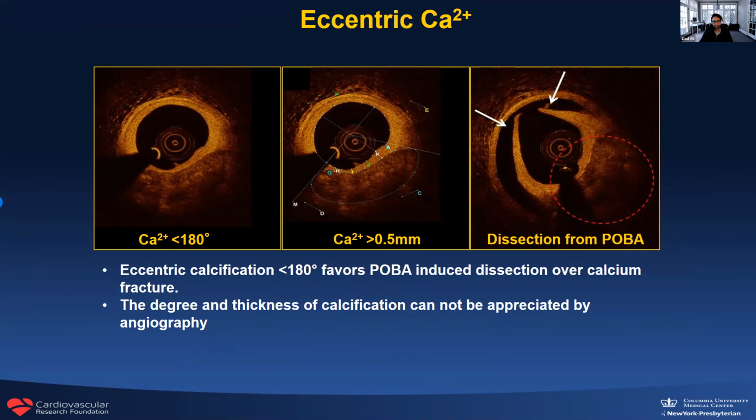fracture in this segment because the bias will always push the calcium away and take the path of least resistance, tearing the intima. If you look at the atherectomy mechanism of action, it is a favorable wire-biased based mechanism. Here, the catheter is pushing into the lumen towards the calcium, and what you can see is that by delivering this, we end up thinning down this calcification significantly, and that allows the following, which is to thin the calcium and finally to induce calcium fracture, which allows stent expansion.